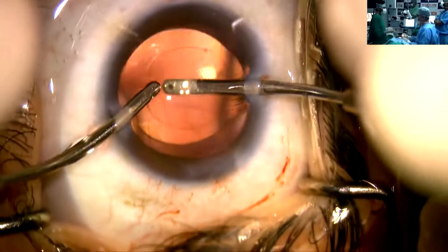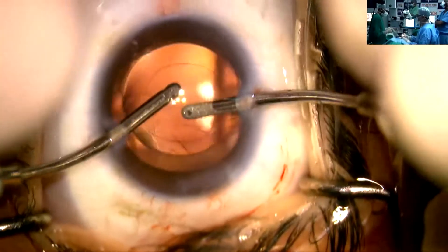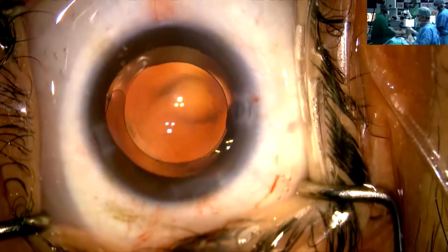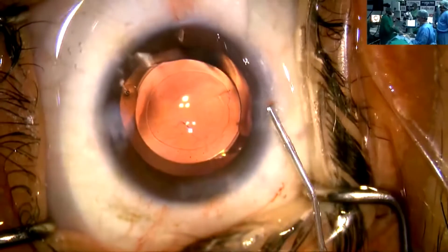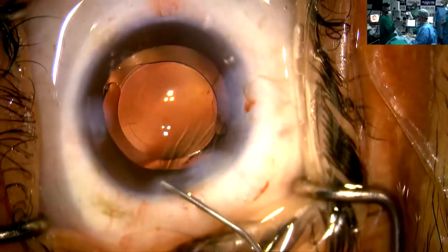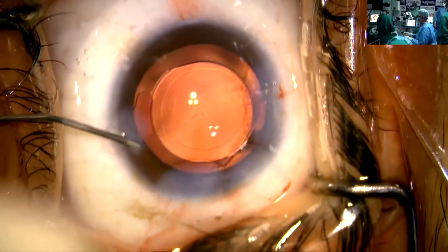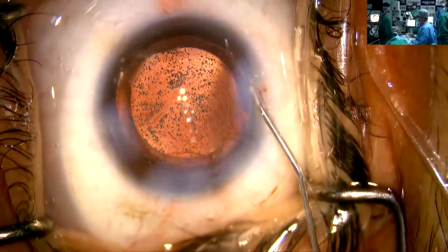Now just cleaning up the anterior chamber — thorough cleaning up is also very important. You can see the ease; there was no surge during this whole surgery. You can see the 1.5 millimeter rim covering the lens and you can see the rings. Now we are almost through with the surgery. This is a mid-segment machine but equally good — I have been operating on intuitive, Alcon machines, and Constellation for retina surgeries. Even for hard cataracts, this machine is very, very good because it has a very good stroke length of 120.